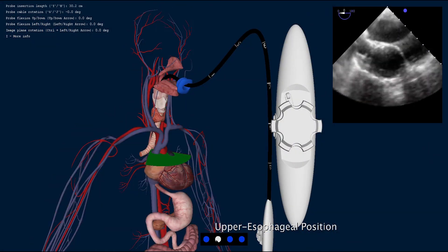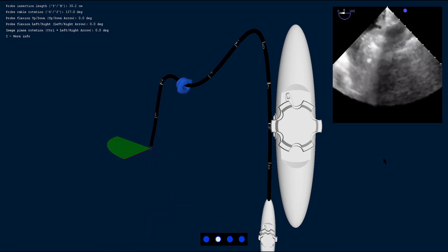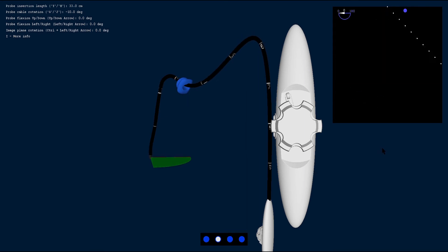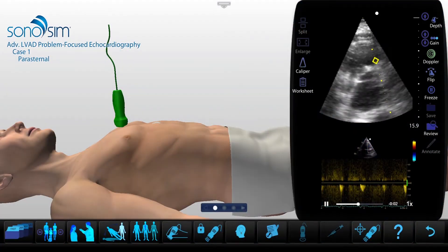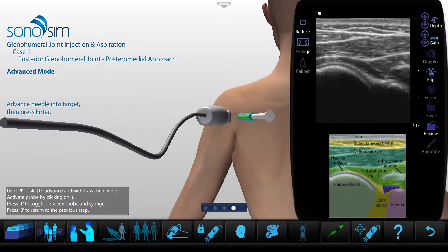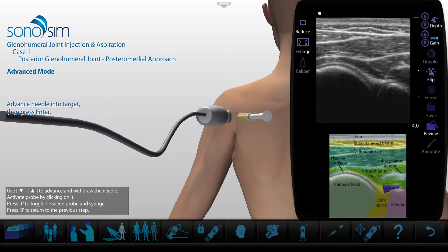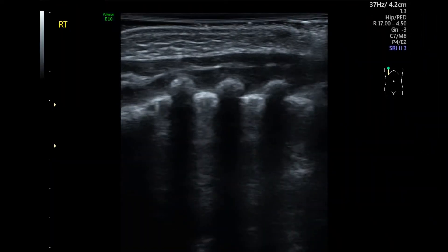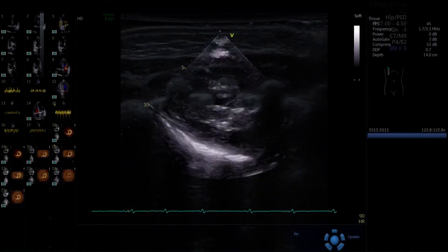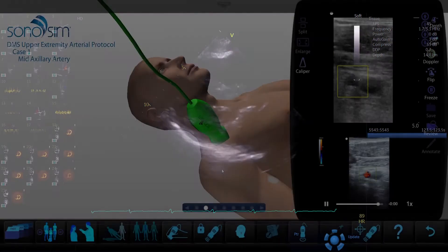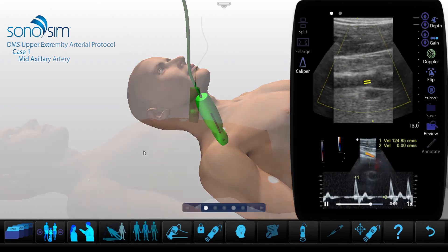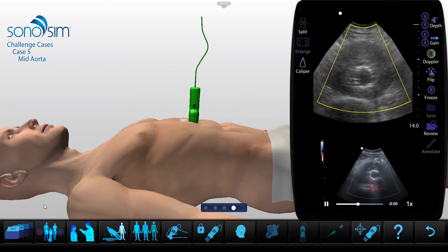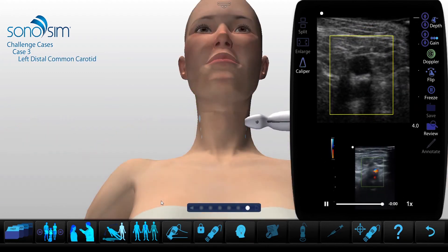In addition to these enhanced features, you will soon be able to access exciting new ultrasound training content in the Sonosimulator, including our new TEE module, LVAD module, our MSK joint injection and aspiration series, pediatric pulmonary content, focused cardiac ultrasound content, vascular training and protocols for DMS programs, and our challenge cases, which contain unique pathologies to challenge your learners, including a triple A, carotid plaque, and a ruptured Achilles.